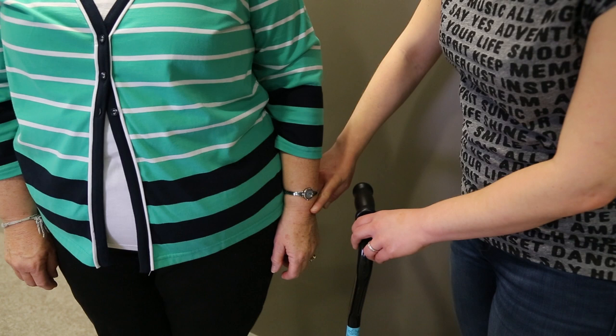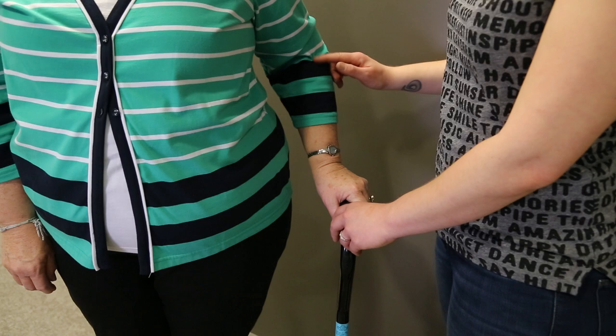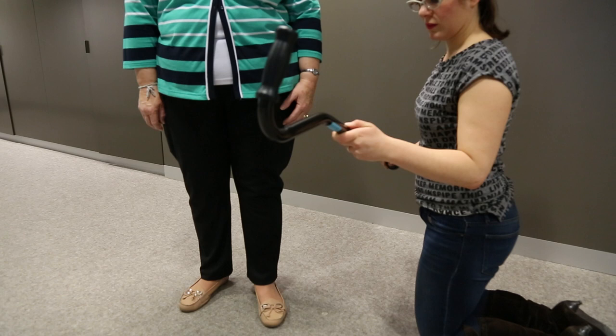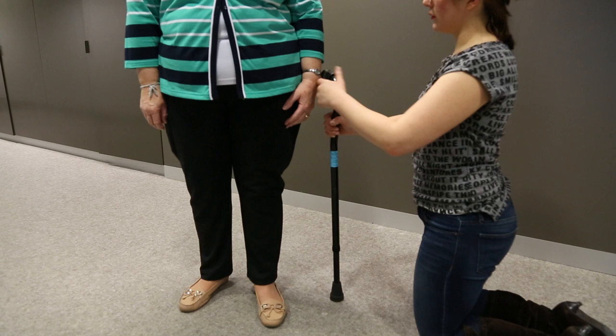The height of the walking stick wants to be level with your wrist crease, and then with your hand on the walking stick, you want to have a 20 to 30 degree angle in your elbow. Once you have the correct height of the stick, it should feel reasonably comfortable with your shoulder and neck relaxed. Too high and your shoulder will be elevated; too low and you'll stoop over the stick.